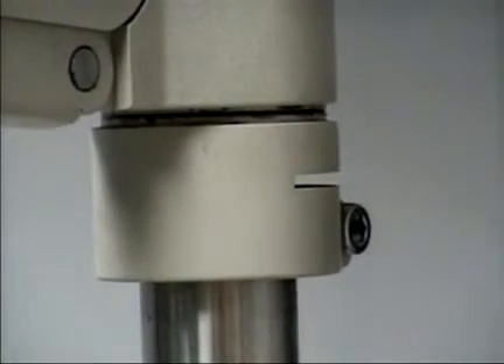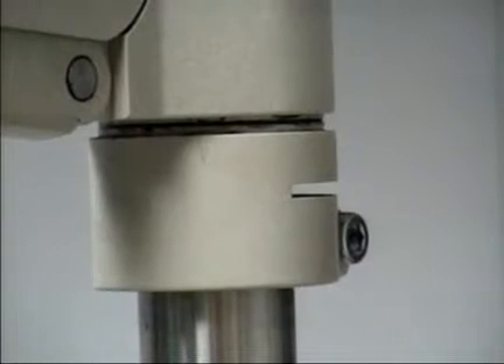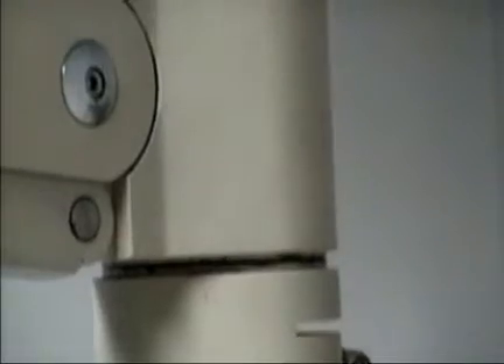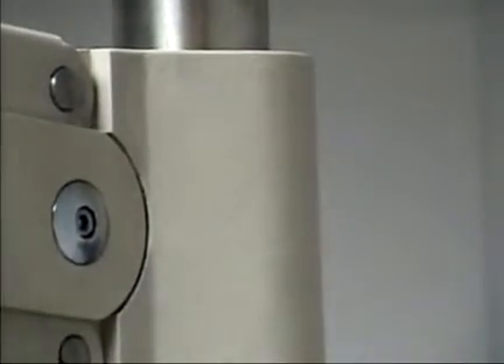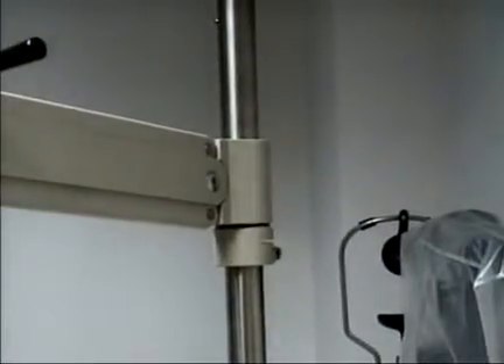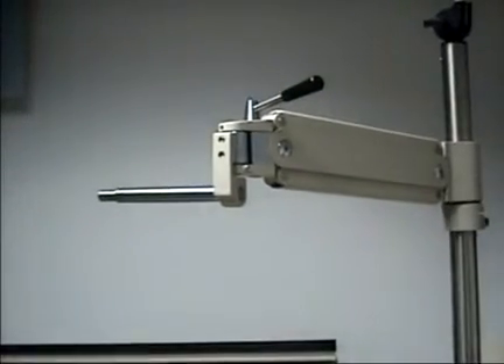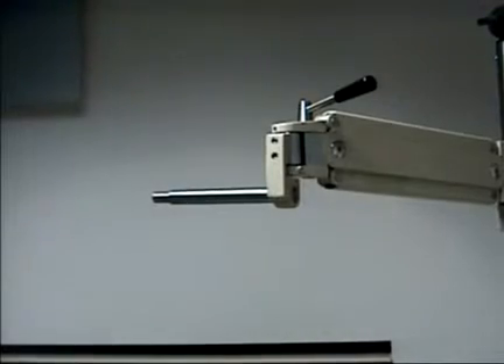The collar of the phoropter arm can be equipped with a quick-release lever; however, you're still dealing with the massive weight of the arm. Furthermore, if you've got the phoropter on the arm, it makes it tremendously heavier.